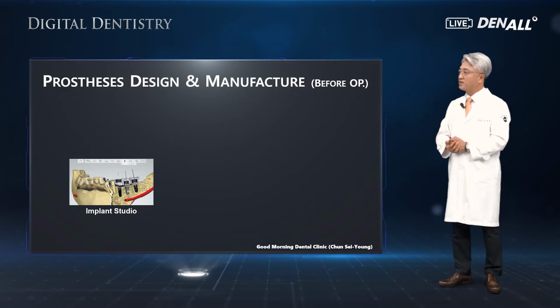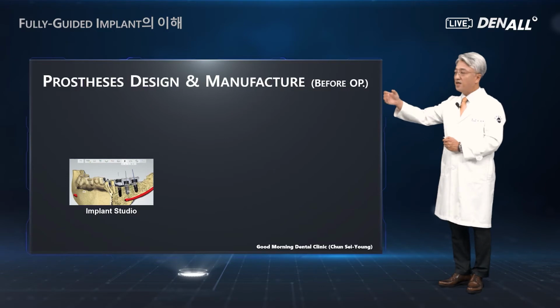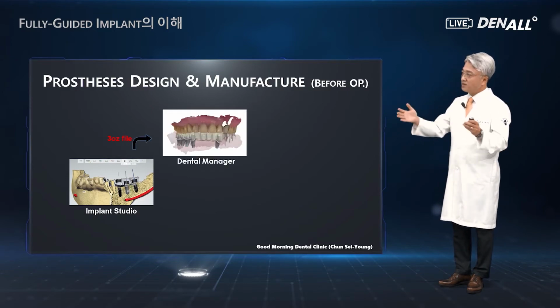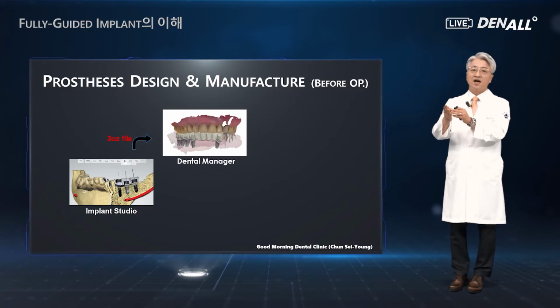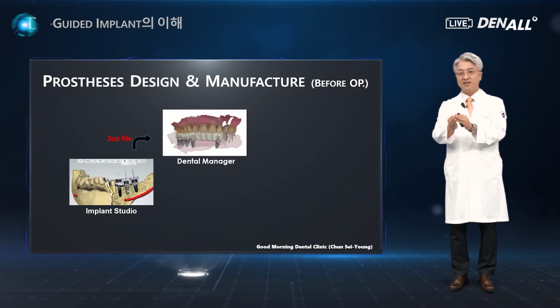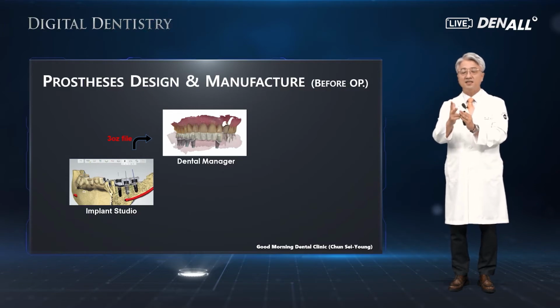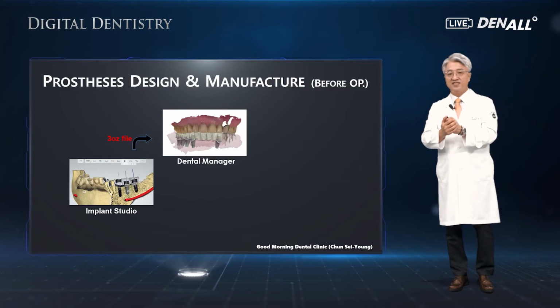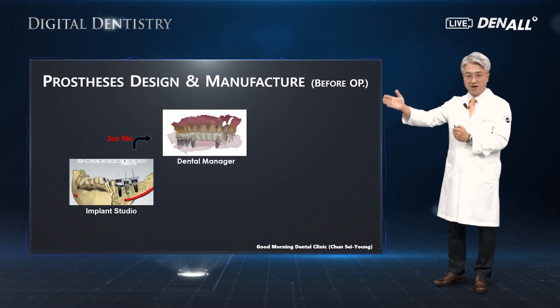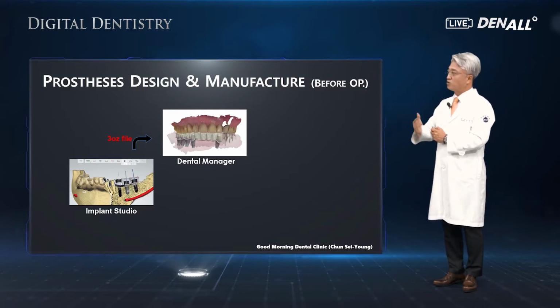First, in an implant planning software such as Implant Studio, the guide and the fixture positions are decided. From there, CT data and the oral scan data and the fixture coordinates and fixture positions, the three will be combined in 3OZ file, and the file is uploaded to a CAD software for prosthesis.